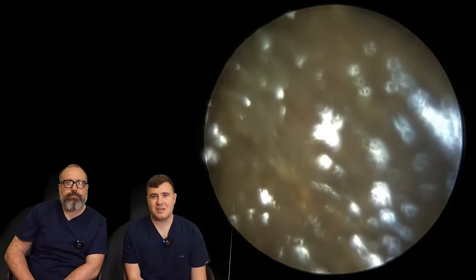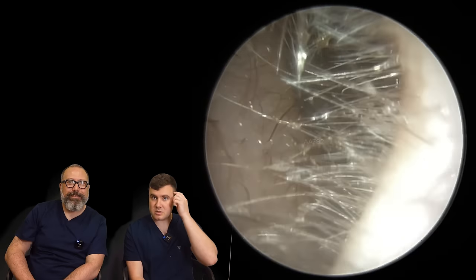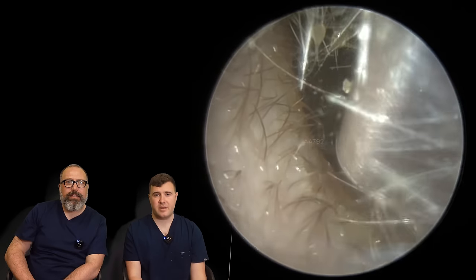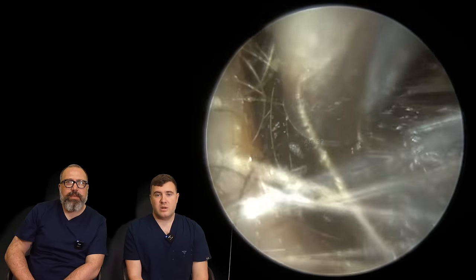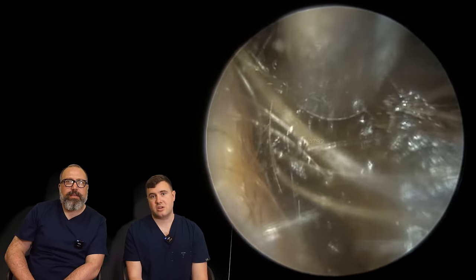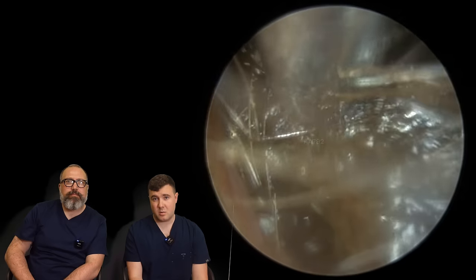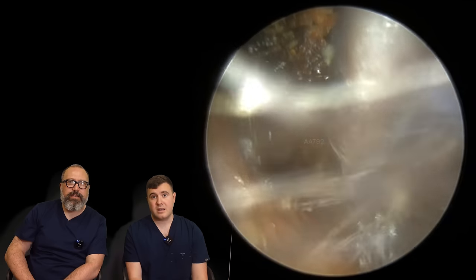Prepare yourself for this one. It's quite a lengthy one. You can see here, as we're looking inside the ear, a very, very thick, dark plug of wax in this side. We know straight away this is going to take us a little while, and we can pretty much see straight away when we're trying to suction this — I'm just not getting any movement whatsoever. That's not going anywhere.